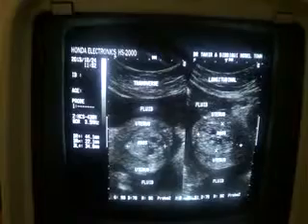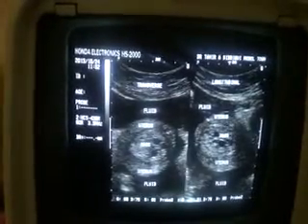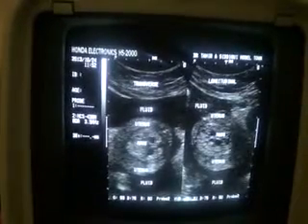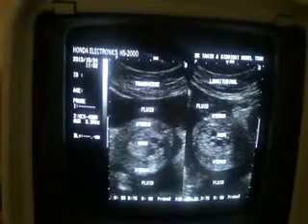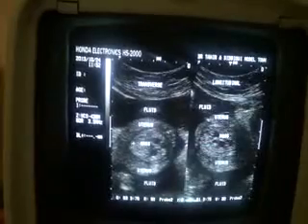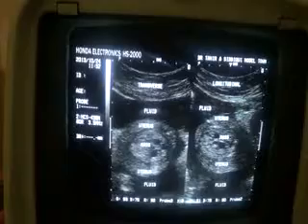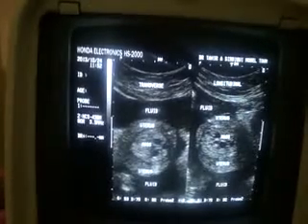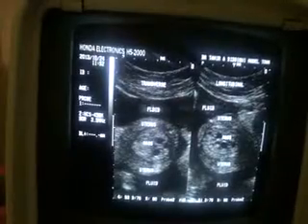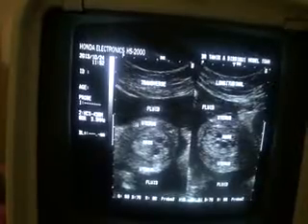See now the outer surface. This is the outer surface, a well demarcated, solid endometrial mass with cystic areas, very tiny ones to a little bigger one, with no posterior wall acoustic enhancement and no calcification. This is the transverse section of the uterus.